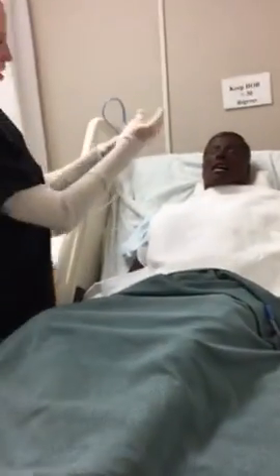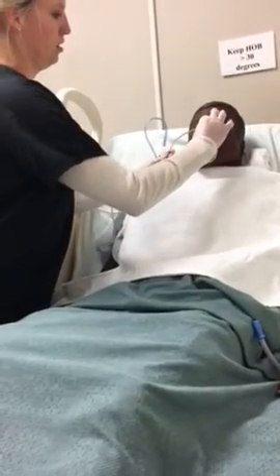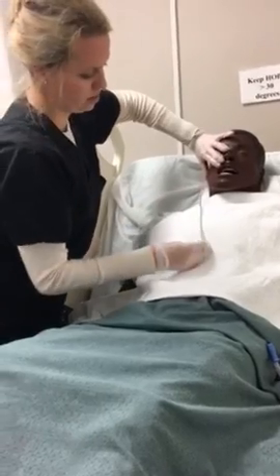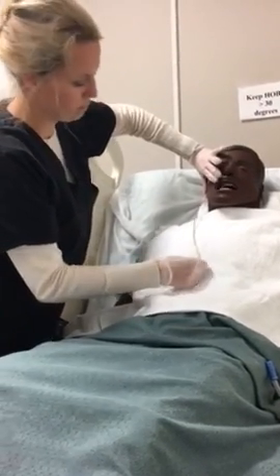So to measure, you're going to take the tip and measure from the nose to the ear, and then to the xiphoid process of the sternum.